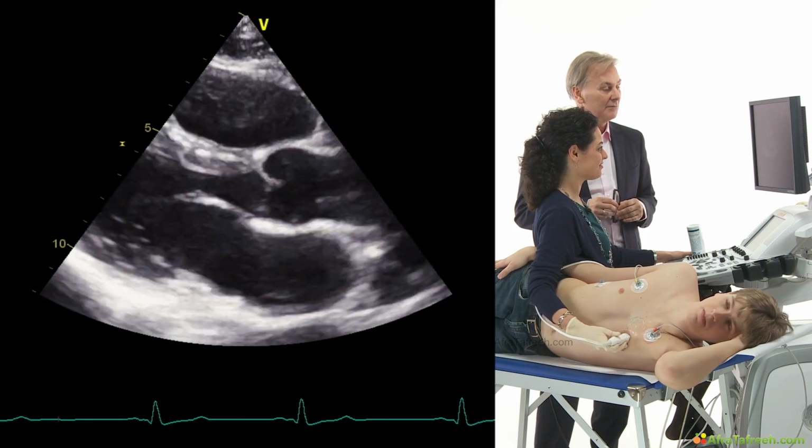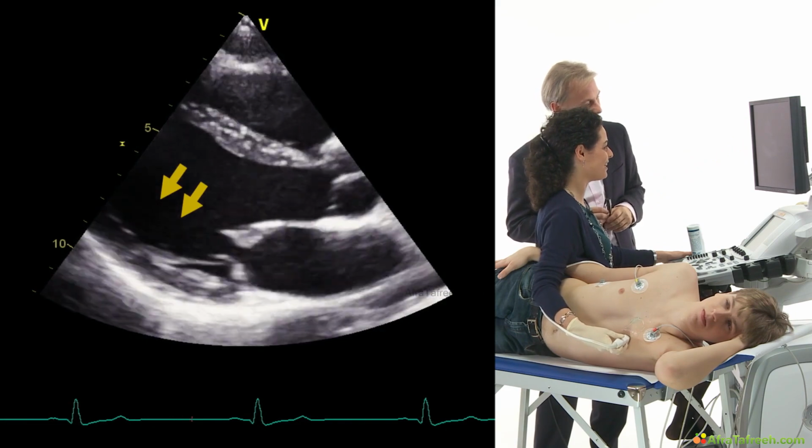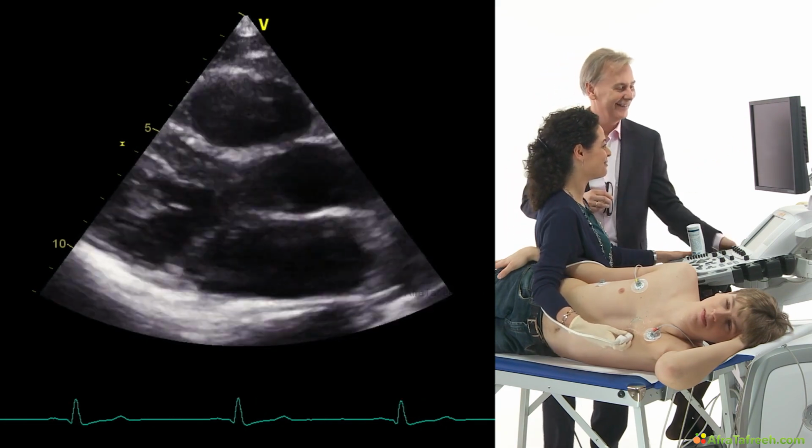And Anna, what is this here though? Do you see these chordal structures there? Yes, Thomas, don't get scared. This is nothing but normal.